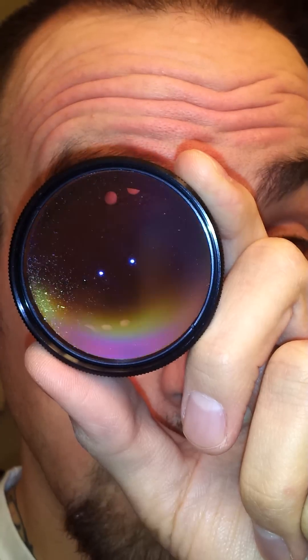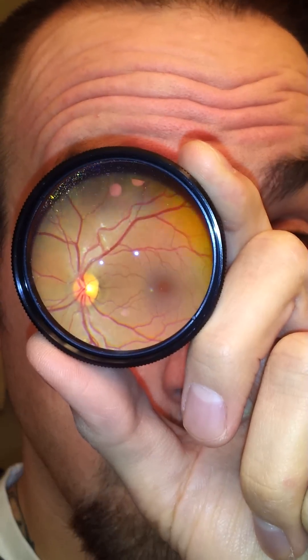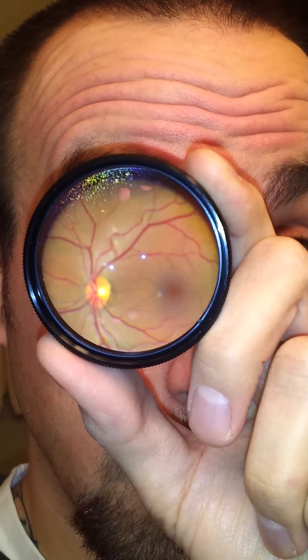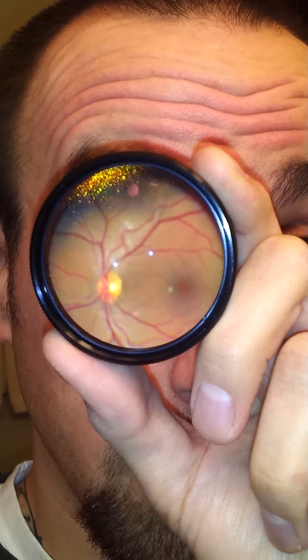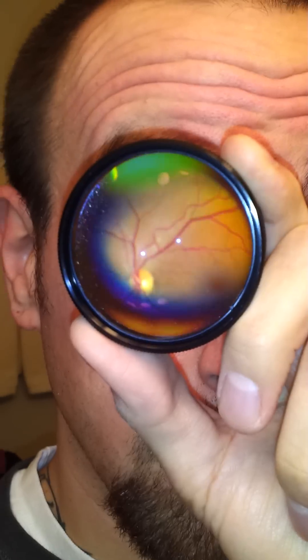That looks pretty good right there. As you can imagine, this light is extremely bright, and the hardest part is getting that working distance just right. But with a little bit of practice it's actually a pretty neat trick. So there you have it — you can see this amount of light.